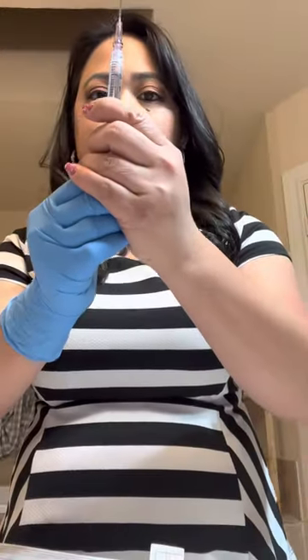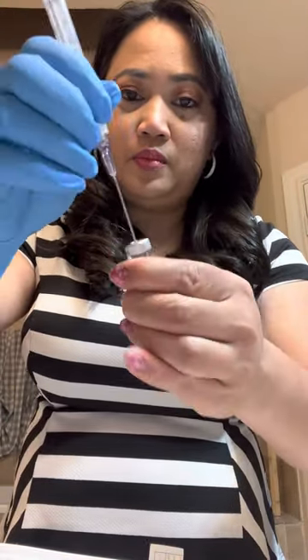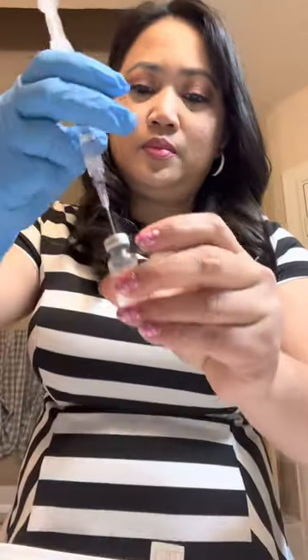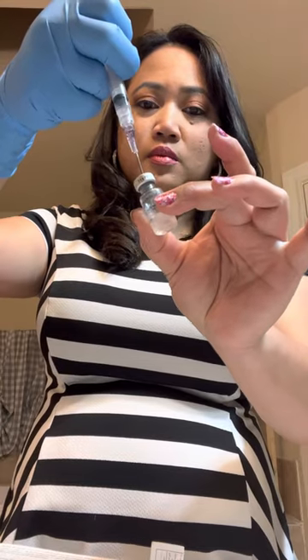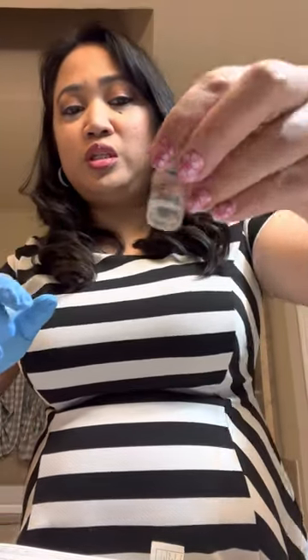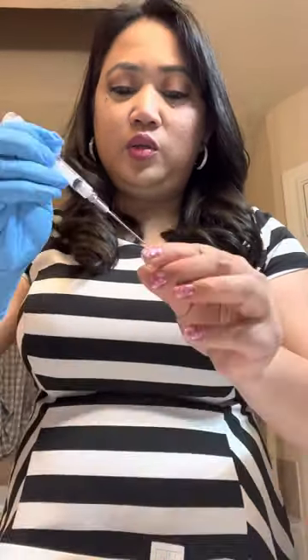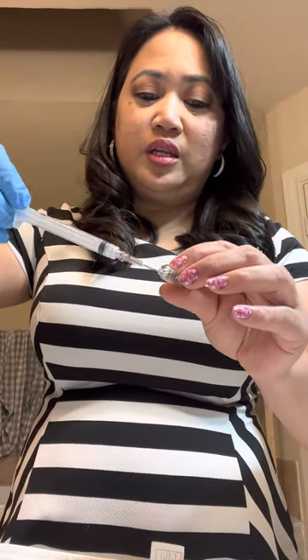There's that — just go ahead and put it in this bottle. As you can see, as soon as you put the solution in, the powder dissolves right away. We're just going to do the same exact thing with the next one.